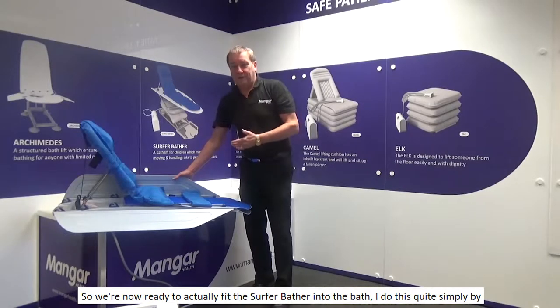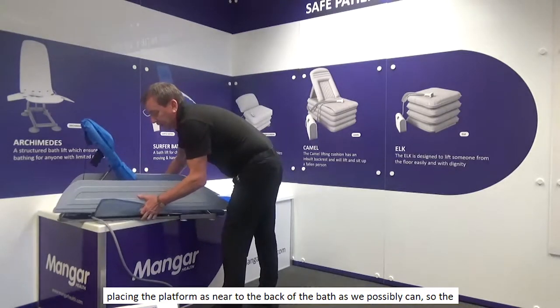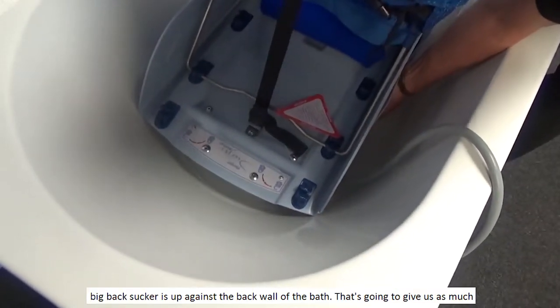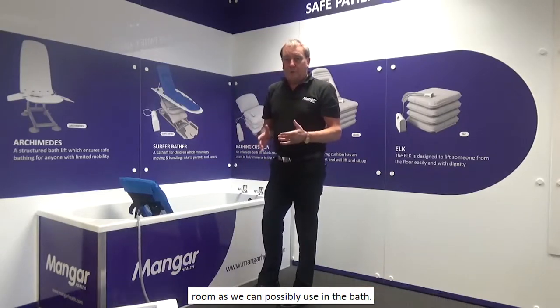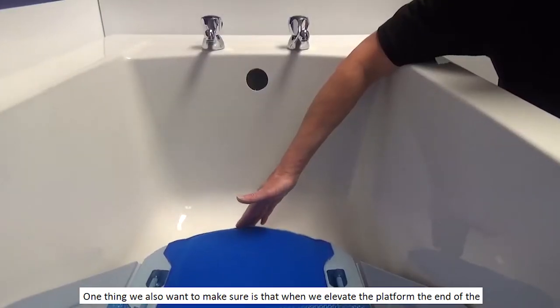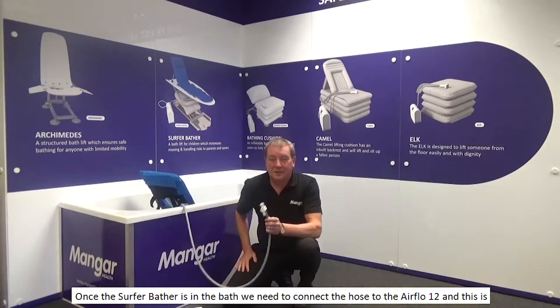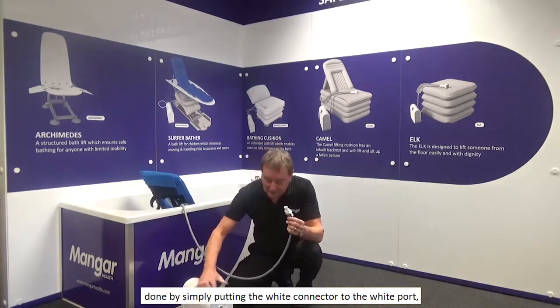We're now ready to actually fit the Surfer Bather into the bath. I do this by placing the platform as near to the back of the bath as we possibly can, so the big back sucker is up against the back wall of the bath. That gives us as much room as we can possibly use. We also want to make sure that when we elevate the platform, the end of the Surfer Bather is short of the taps. Once the Surfer Bather is in the bath, we need to connect the hose to the Airflow 12, and this is done by simply putting the white connector to the white port.